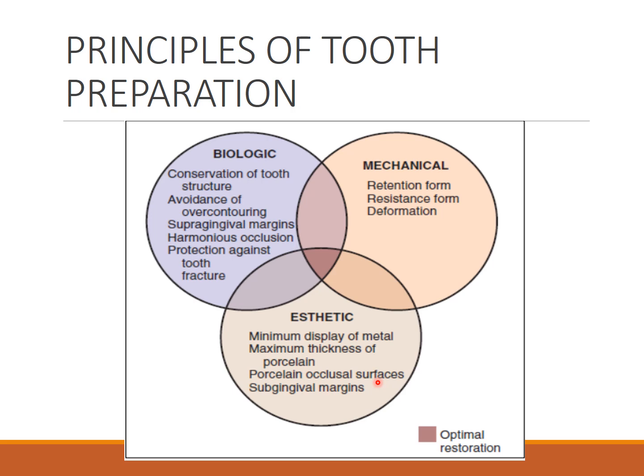If you maintain these three principles, the tooth will have long-term oral health, and it will give you proper efficiency. Once you combine these, as I was talking about, you'll get an optimal restoration.